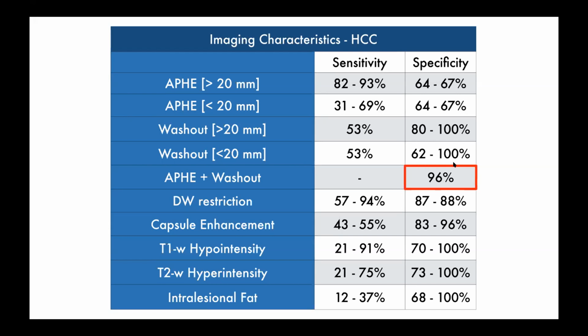Certain observations which showed very late washout or did not show a uniform pattern of washout were actually the problematic cases in our spectrum, which turned out to be either atypical cholangiocarcinomas, what we call collision or combined tumors, or even sometimes HCC with lymphomas, which can behave in a very unusual pattern. We also saw hepatocellular carcinomas with neuroendocrine differentiation, which can also cause some problems. But by and large, when you use only these two criteria, your percentage specificity is as good as it can get with any kind of imaging modality.